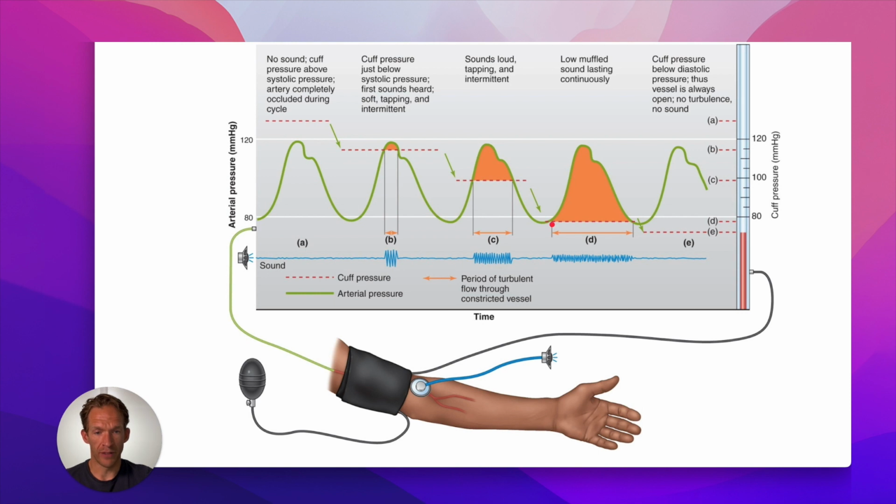So you will still have a small sound until you go lower than the diastolic pressure.